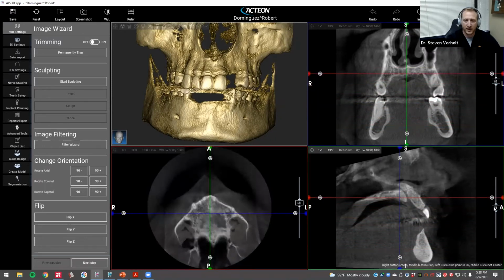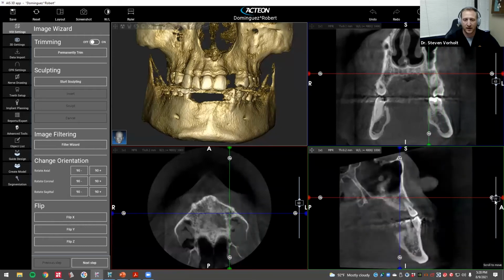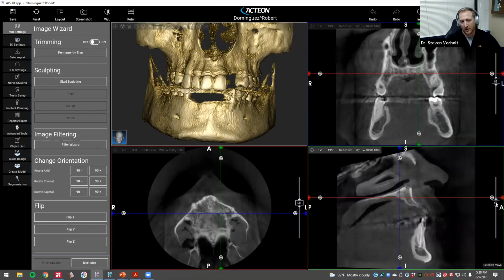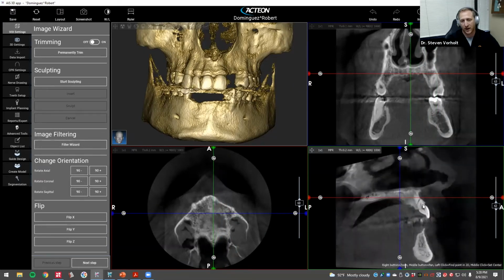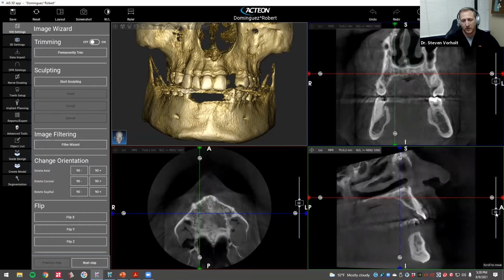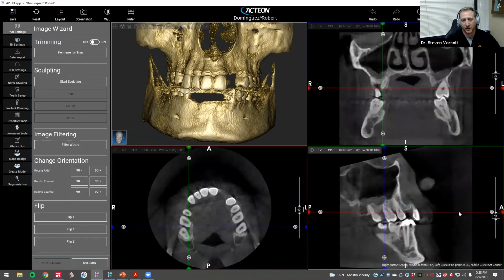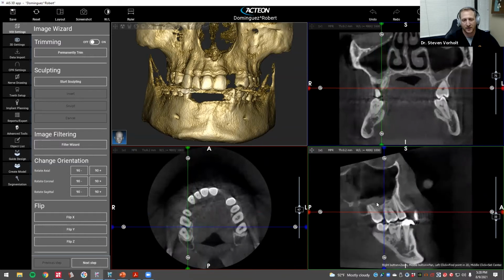Okay. We'll also take a look at the sagittal slice, and we'll take a look in the posterior section, look at the sinus, a little bit of sinusitis in the patient's upper left side. As we come across the anterior, we notice an undercut in the number 10, 11 spot. There's our fracture again in number 9. And as we come around, we're going to look at the upper right. And here's the inactive or active periodontal stuff in the molar region that we can see there. Some of the vertical bone loss and a little bit of sinusitis as well.